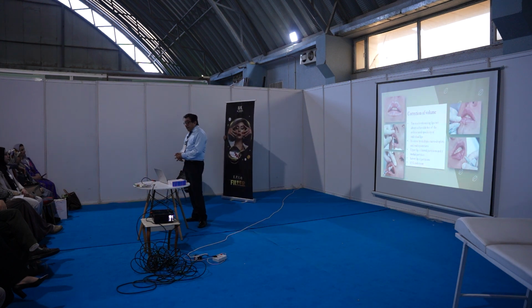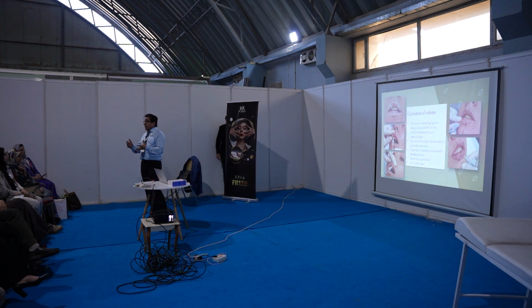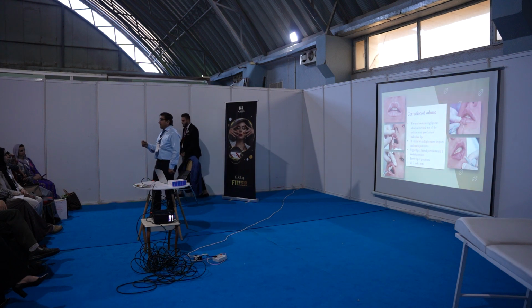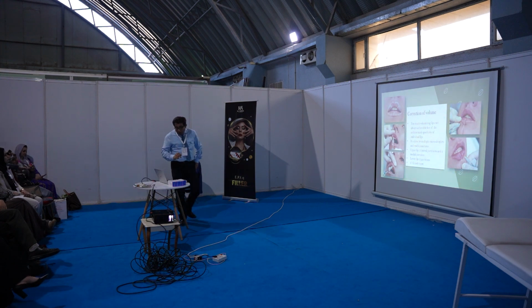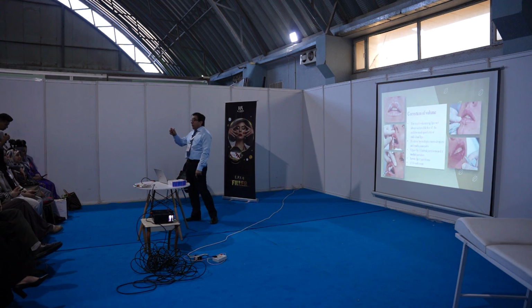Volume is the second thing that we talked about. In the case of the very young, they need only volumization, but the volume of the lips should not exceed 1 cc, because the mean volume of the lips in the whole community is 1 cc. And this is done through multiple micro droplets.